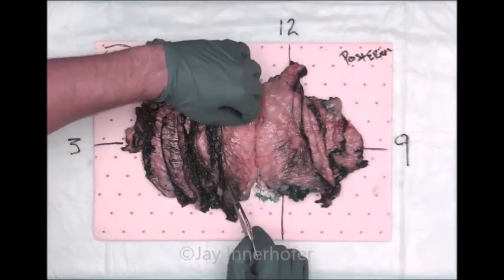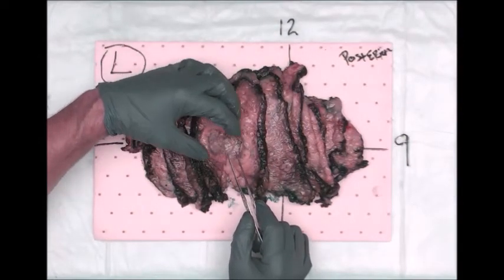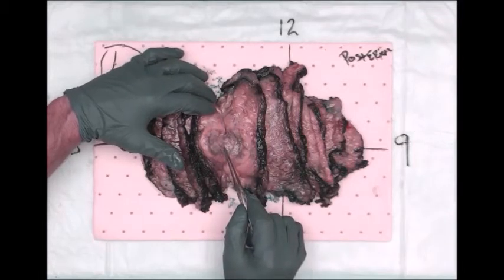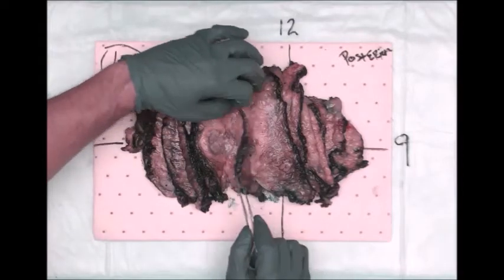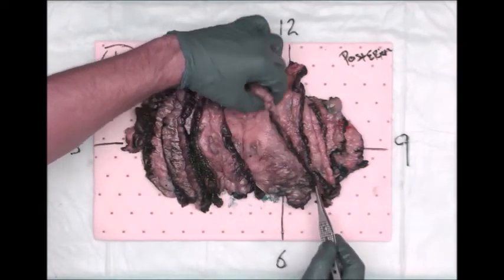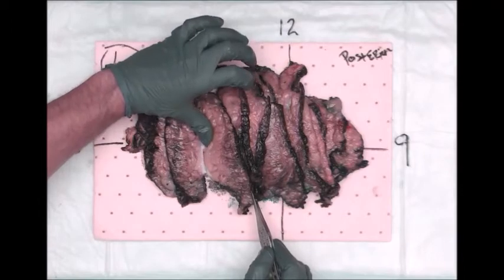And as I went farther and farther along, as you recall, when sectioned through the breast in this area, all this mucoid, almost purulent material came out. And what actually is going on here is there's this necrotic mass right in this region. It's subjacent to the indurated area of the skin, okay? And so it begins about right here, and then it goes this direction for 1, 2, 3, 4 slices, and actually ends about right here.